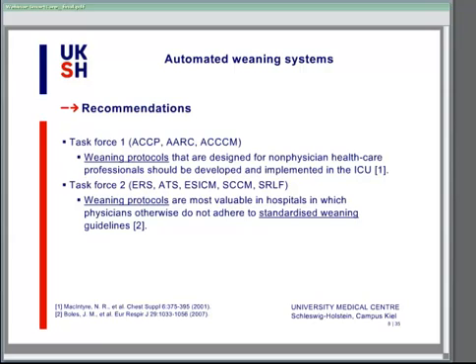But you do not solve your problem just by hanging a weaning protocol at the bedside of the patient. We know that it is very hard to implement such weaning protocols into the daily clinical routine.